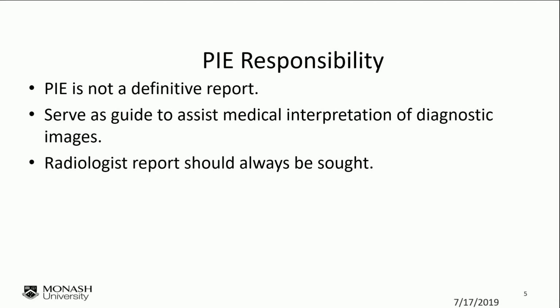So remember that a preliminary image evaluation is not a definitive report, but it merely serves as a guide to assist medical interpretation of diagnostic images. And the gold standard, which is the radiologist report, should always be sought to confirm your image evaluation or preliminary image evaluation of the images.